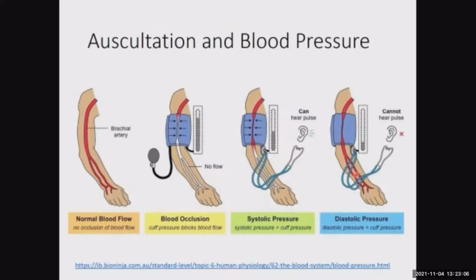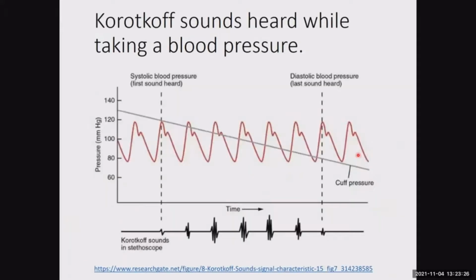And so it's going to be quiet again, similar to what we had over here with the normal blood flow, because we haven't impacted the wall of the vessel. We haven't caused any partial occlusion or anything going on. We're not doing anything to contribute to the babbling brook. We're not doing anything that's going to contribute to the turbulence that we can hear with our stethoscope. Now, as I mentioned, the Korotkoff sounds are what we're listening to when we're hearing the blood pressure.